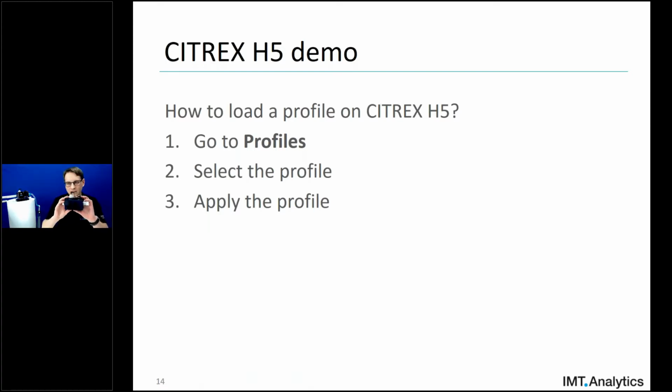I have a CITREX H4 here with me too. And with H4, it is not possible to create the profiles on the device itself. Here it works different. We have to create the profile on the SD card of your CITREX H4. So to do that, either we can connect this micro SD card to our computer, what I will do here to demonstrate it, or we can also connect the CITREX via USB cable to our computer.